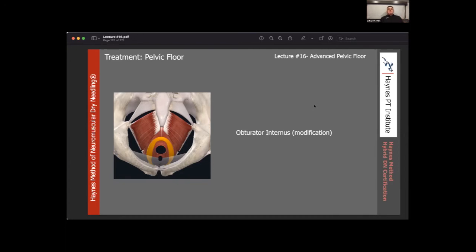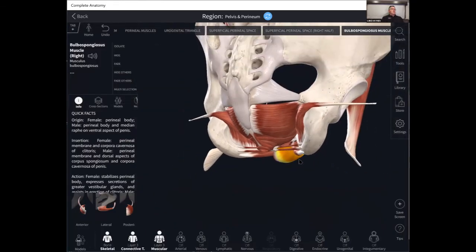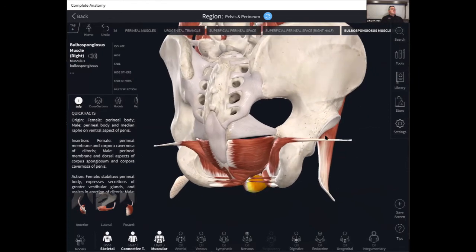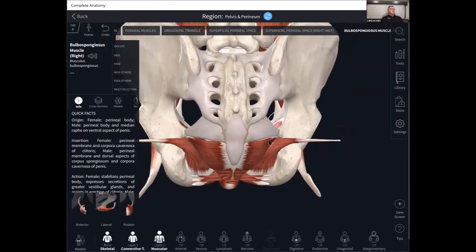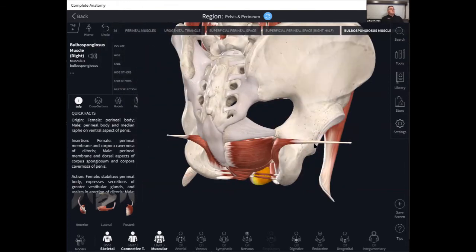Well, here we have the opportunity to needle into the obturator internus a little bit more effectively. I've taken everything else out, but assuming that the femur, the ball, the neck, the tuberosity out here, and this is obturator internus, with this small tendinous piece coming way over here.